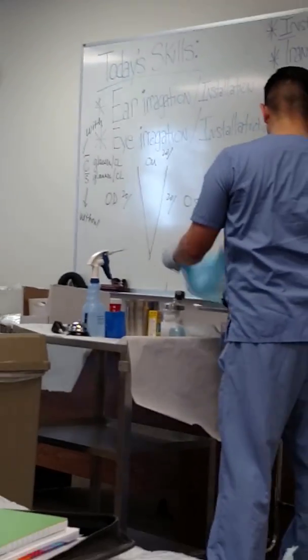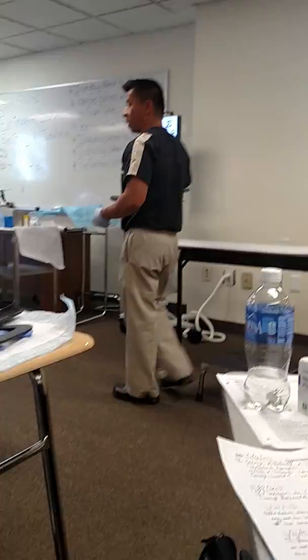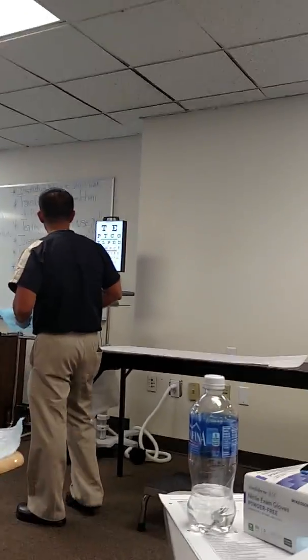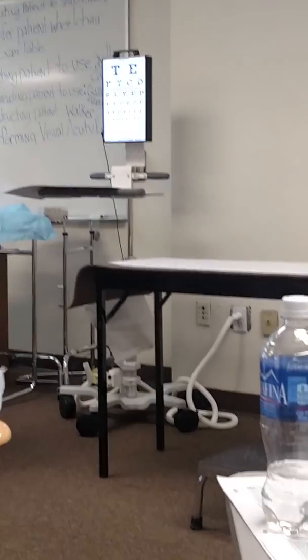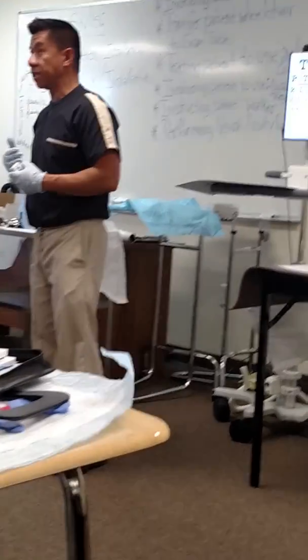Now, there are so many ways. The manual, traditional one is the visual acuity using the E or the Snellen chart or the big E chart. Are you guys with me? And now in the clinic, we have some high tech. As the technology comes in, we have an electronic visual acuity device that you can check. Normally, they say 20/20 vision. Are you familiar with that? What's your vision? 20/20? That means you can see an object at a 20 feet distance.